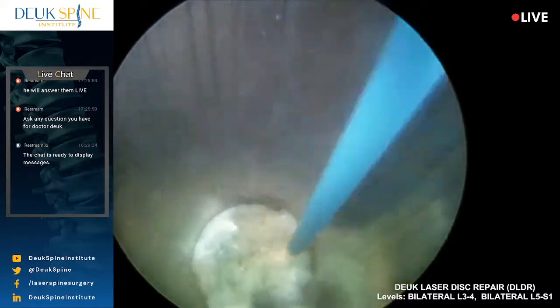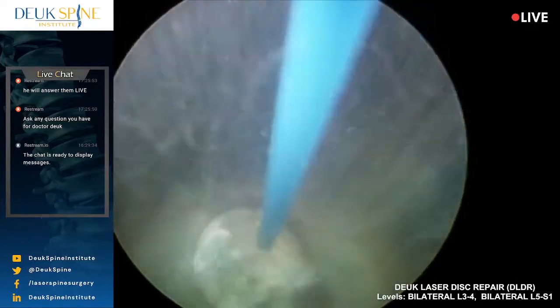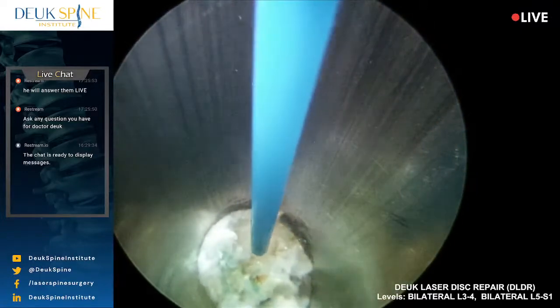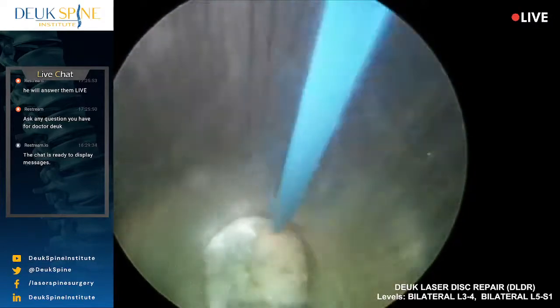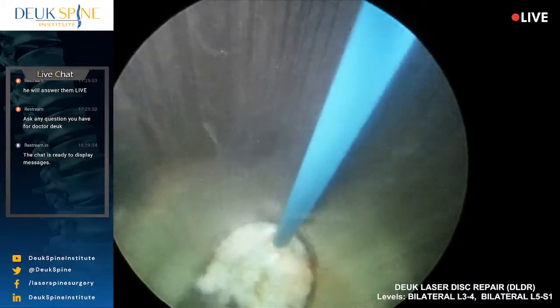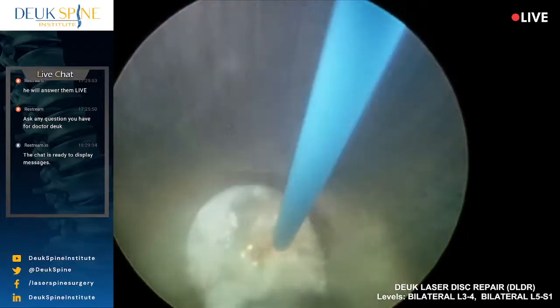Yeah, there's no other way to describe what I do except debridement. It's what it really is, a debridement. And debridements are not something that neurosurgeons do a lot of, but orthopedics do. And what they debride is tendons, menisci, joints, to get rid of the arthritis in there and get rid of the pain.